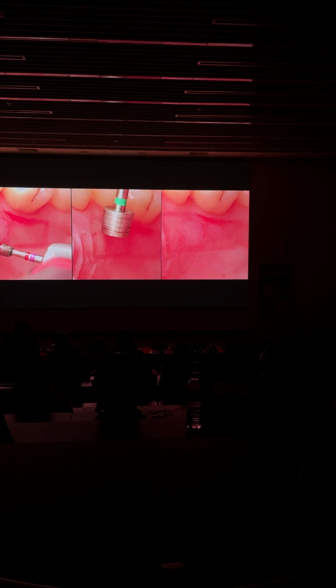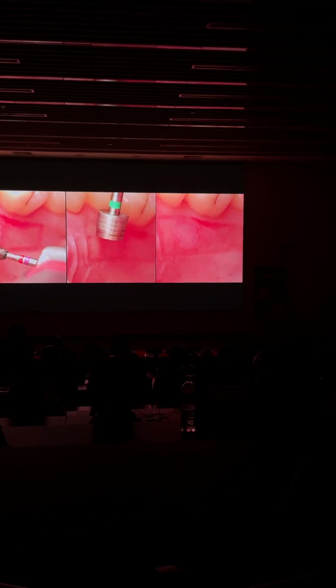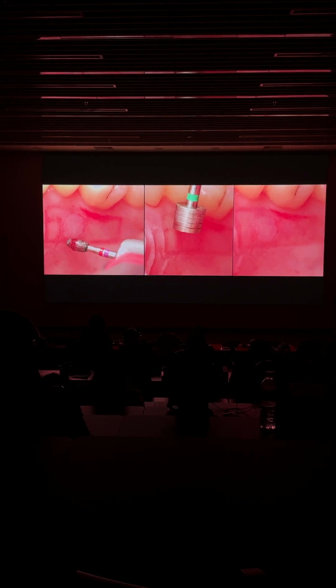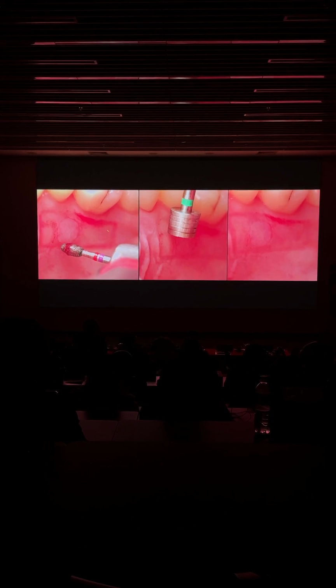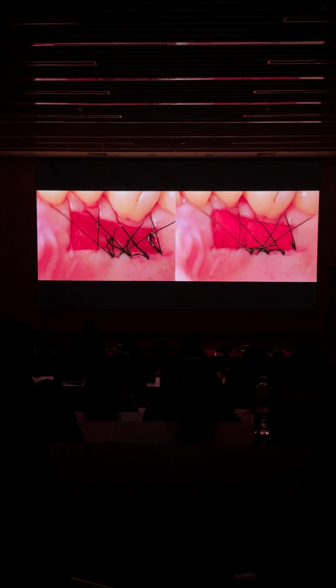The palatal is always shorter than the buccal. And the incision is just 1 millimeter in depth, the center. So this is the epithelialized tissue. As I showed you yesterday, I first de-epithelialize with my burr, and then I cut to guarantee that there is no epithelium left on my corners.